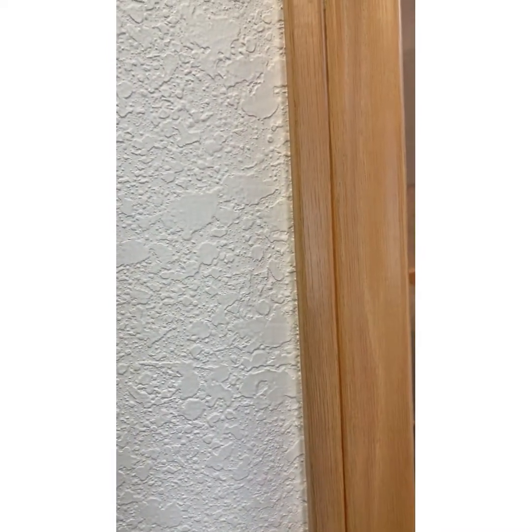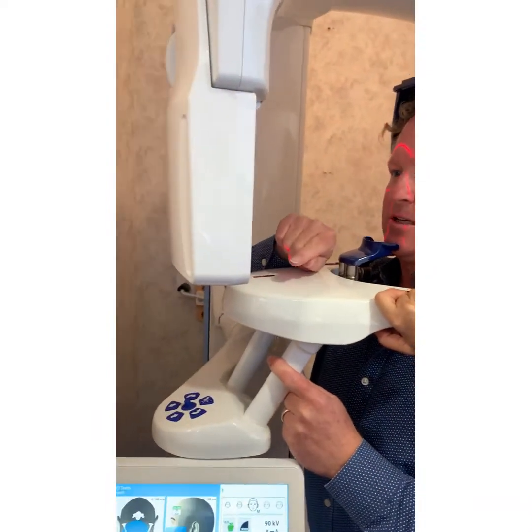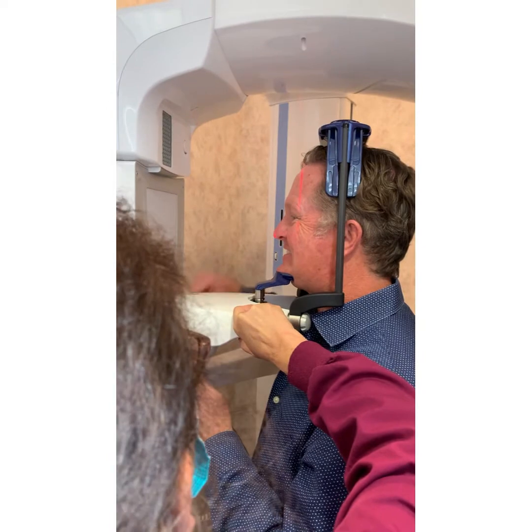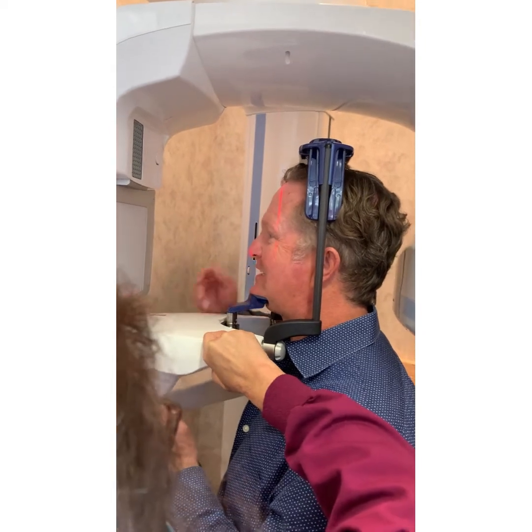Let me see. Is that it right there? No, it's not on it. You want to be in front, and from your perspective, it's a little different than seeing it from this perspective. You're on 8, you're too far back. You have to come forward towards you. Move it so it's right in front of 8-9. Don't put it on 8 or 9, but right in front of it.